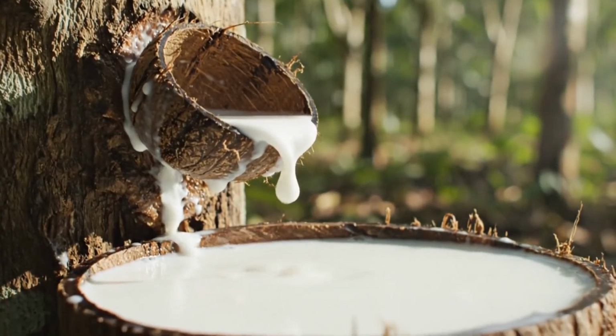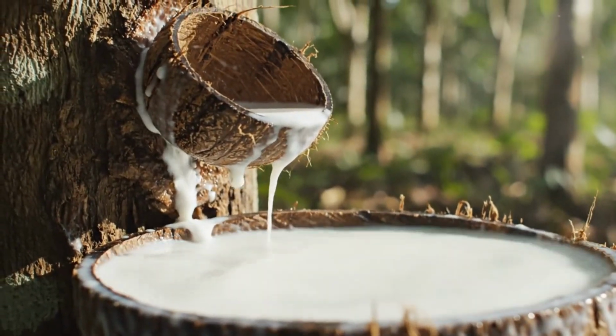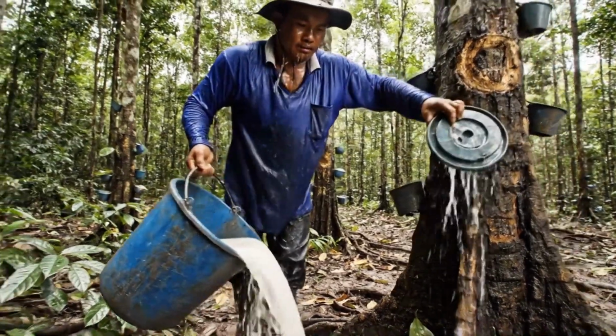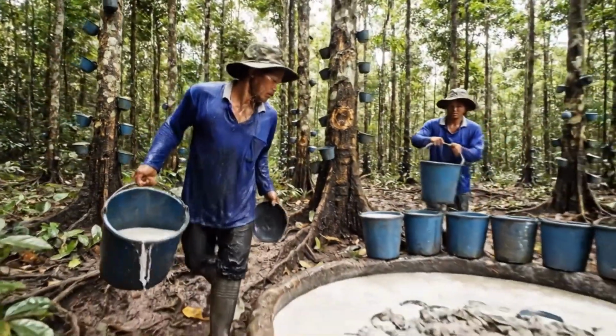This raw latex is a complex emulsion of water, rubber particles, and natural proteins. Thousands of trees must be tapped daily to provide the volume needed for global production.